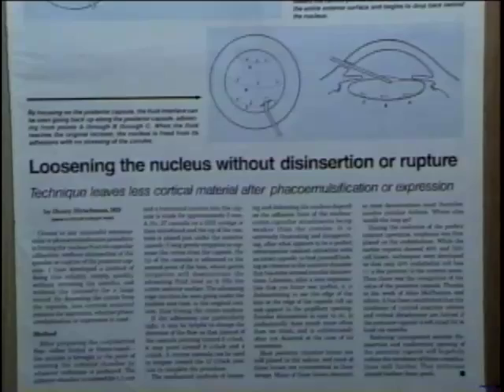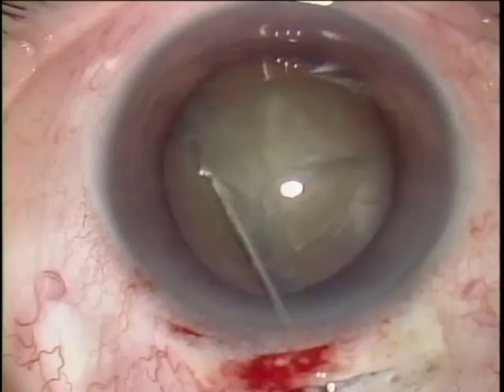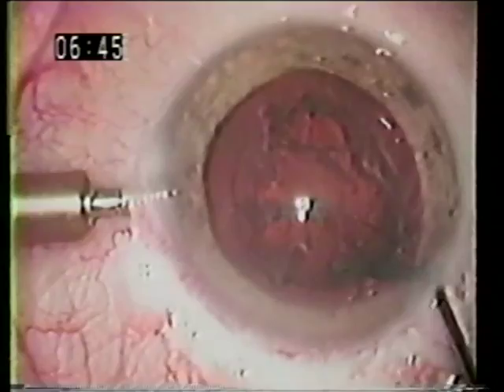More recently, Dr. Stephen Brent and others have continued to define the role of the hydrosonic system, an instrument designed by Dr. Anise for hydrodelineation and nuclear fracturing. Dr. Michael Blumenthal is credited with coining the term epinucleus and popularizing hydrodelineation with this lamellar separation for planned extracapsular surgery.